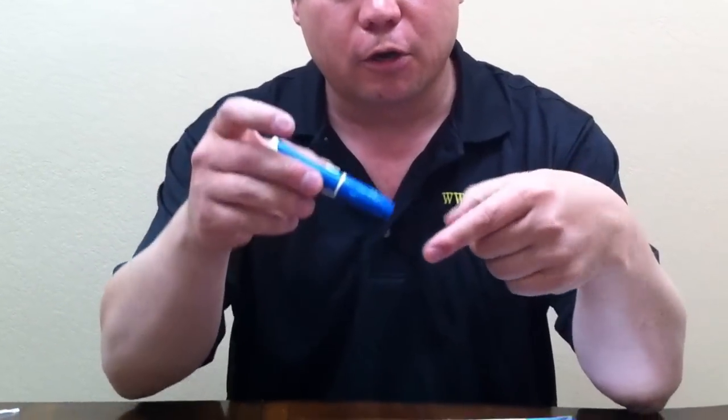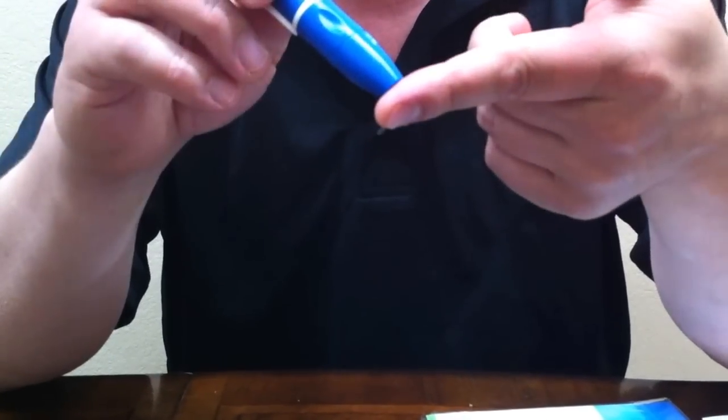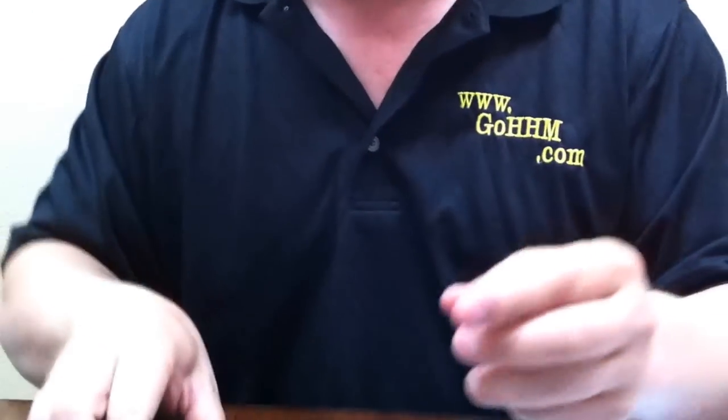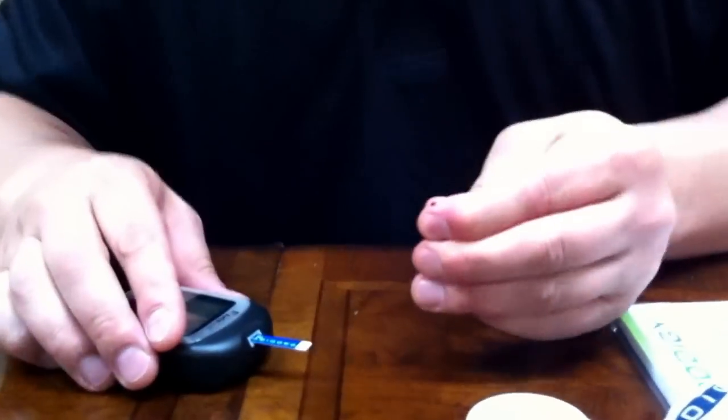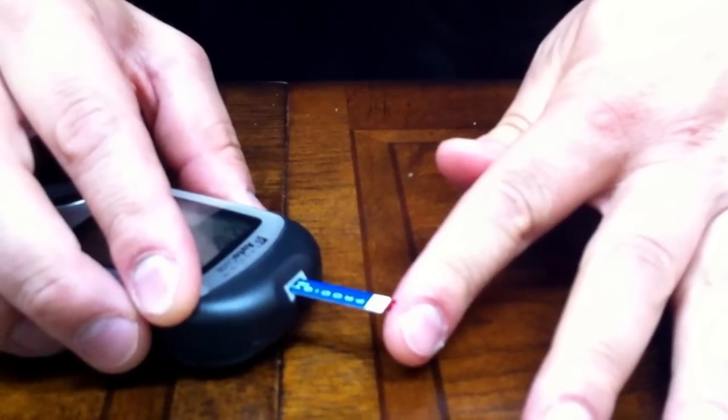Now, to get blood from your finger, many people go right into the middle of their finger — we're not going to do that. First thing we're going to do is squeeze our finger, which gets a little bit of the blood flowing. At that point, we're going to go into the side of the finger. The reason we're going into the side and not the pad is there are less nerves here and therefore less chance for you to feel pain. Once the blood is flowing, we will bring the meter over to the finger.